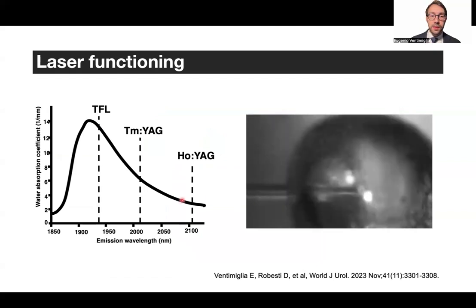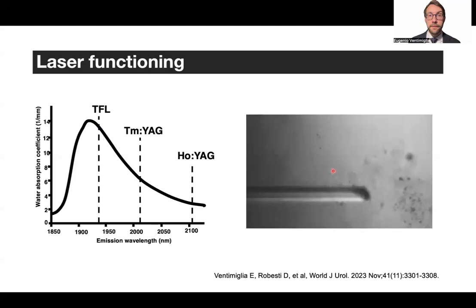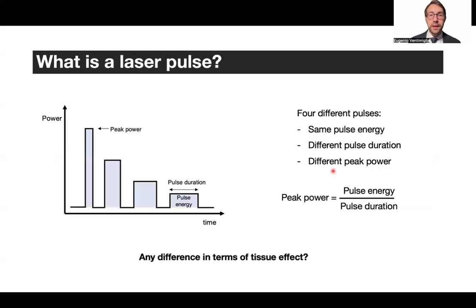So each of these lasers is absorbed differently by water, and therefore the effect they will have in terms of bubble will be again different. Another key concept we need to understand is that each laser can emit in pulses, and each pulse can be different according to its characteristics.